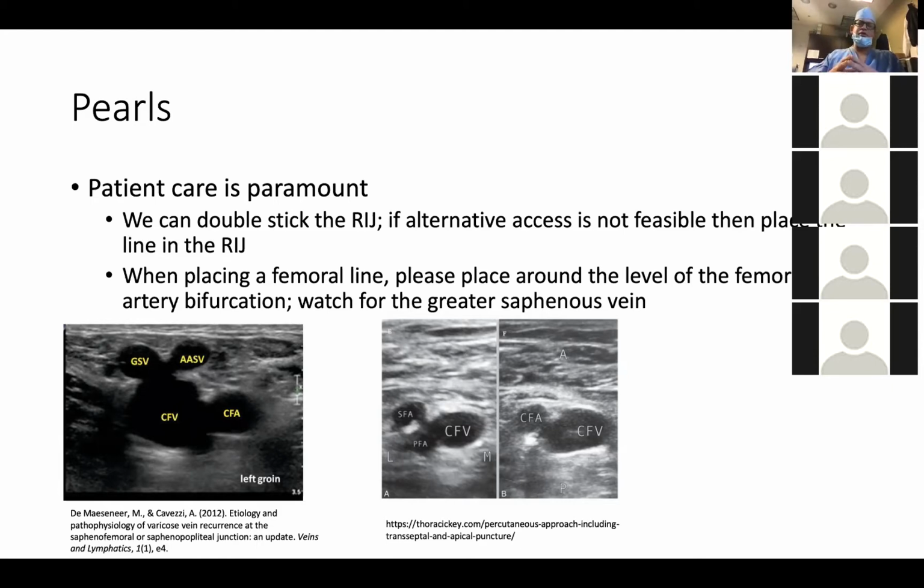The issue becomes if your cannula goes right down the middle there, it's going to shear those 2 veins off of the common femoral. So when you pull that femoral cannula, you're going to get a huge hematoma and you're not going to know why. You're also going to get a lot of cannula oozing, which is going to be a lot of phone calls. And you may think, cannula oozing, we'll come and we'll put an extra purse string stitch in, we'll hold pressure. You're right, it's venous bleeding.